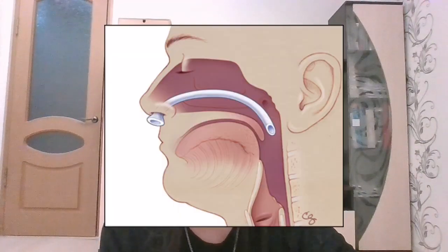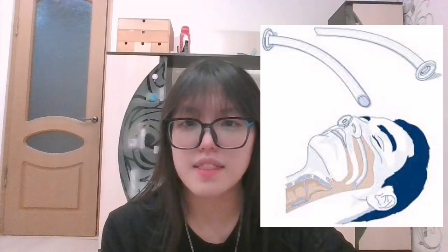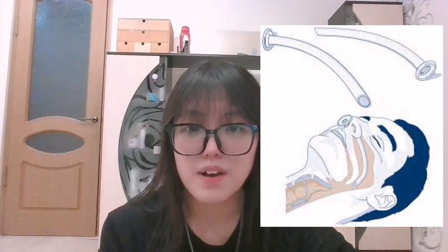Good morning everyone. Today I will talk about how to insert a nasopharyngeal airway. Nasopharyngeal airways are flexible tubes with a flap at one end, and they are inserted, non-flanged end first, through the nares into the pharynx.